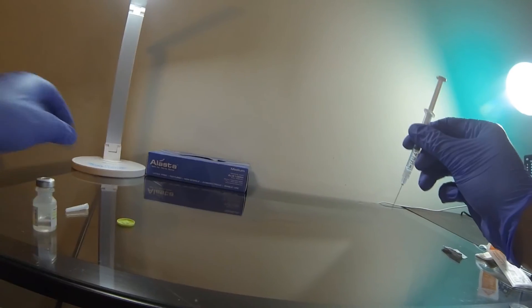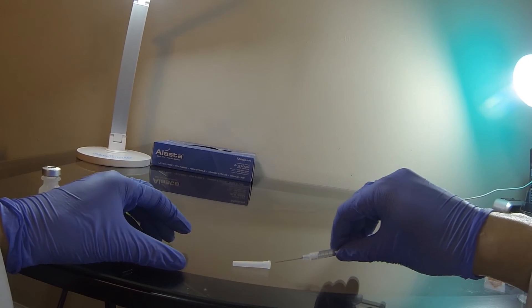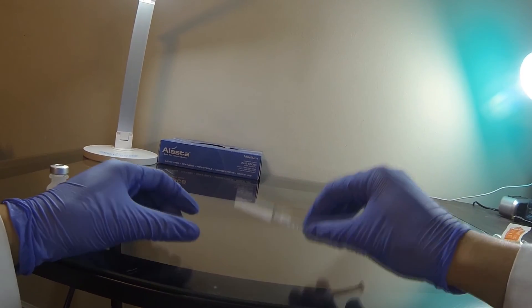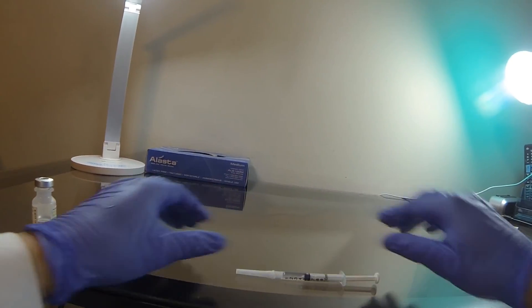You can inject into the patient if they're ready, or recap for later use. When recapping, place the cap on a flat surface, and then using only the hand holding the needle, scoop it up. When putting this together, make sure you hear the cap click so it doesn't fall off later.